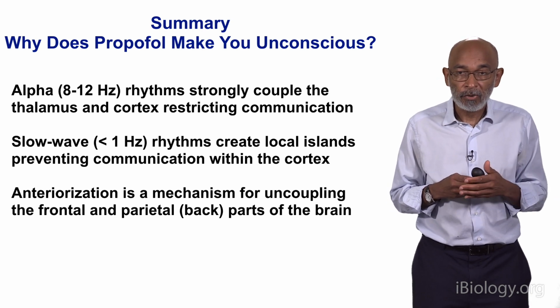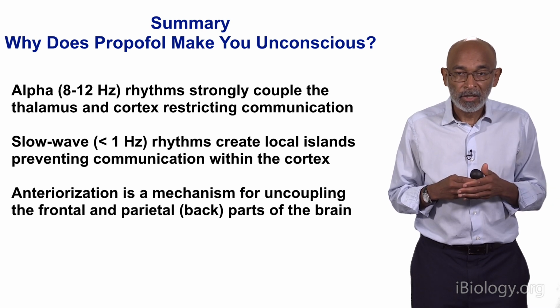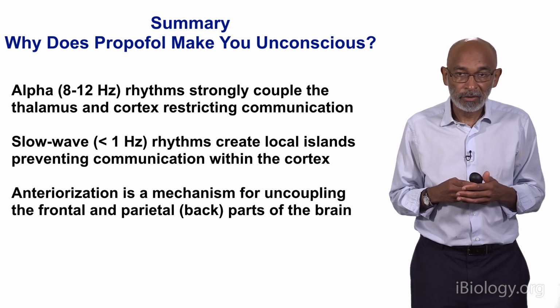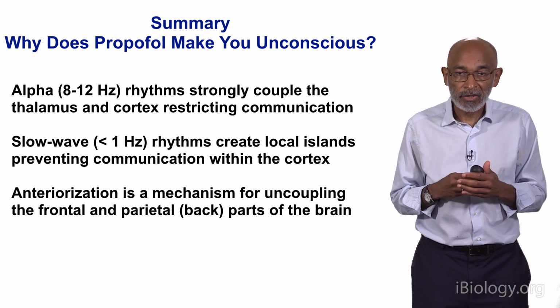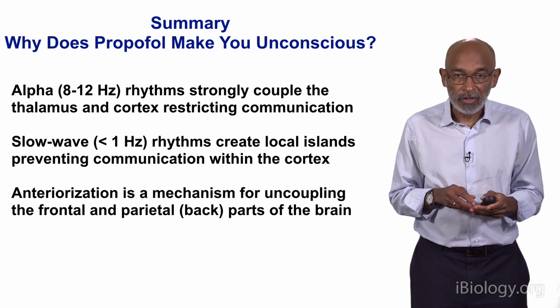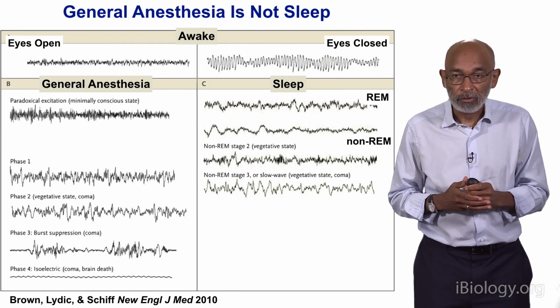Part of the reason that this problem still persists today, even in 2019, is that most anesthesia care is given without using the EEG in the way that I'm suggesting. So this is an easy issue to fix, but there's a way of fixing it not just by using patterns, but also understanding the dynamics that underlie those patterns. I want to make one final point.